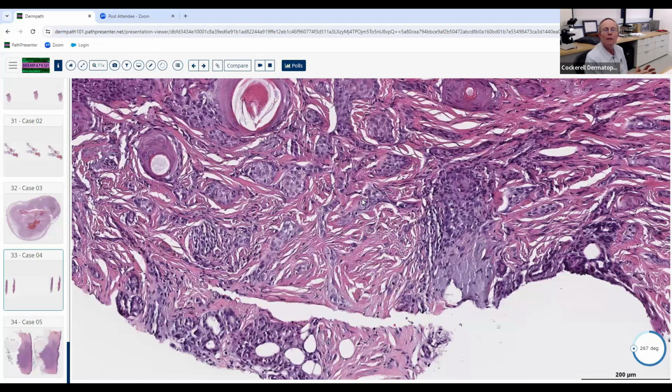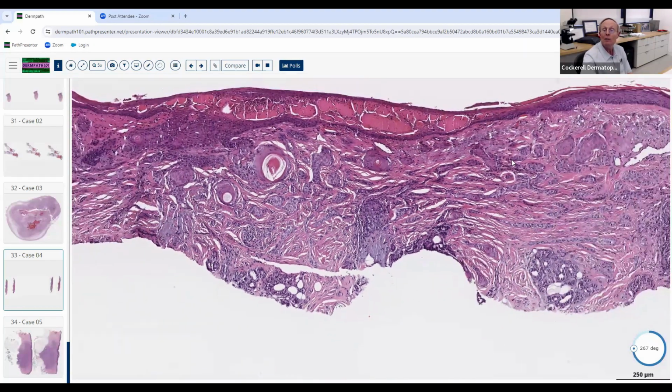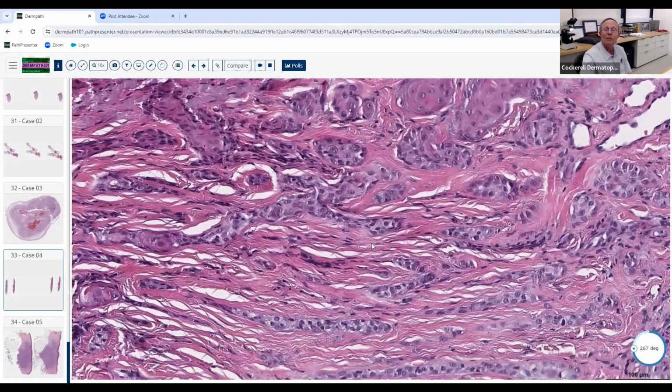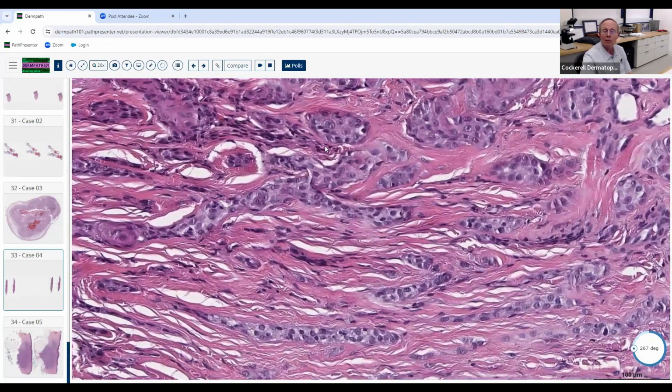pattern. We commonly do get shave biopsies of these because clinicians usually send them in as a scar. They're often white lesions on somebody's head and neck area, often of a woman. They don't think of a cancer, so they take a shave, and we see the surface of a sclerosing epithelial neoplasm. And then the differential diagnosis there includes three classic things when they're primary in the skin.